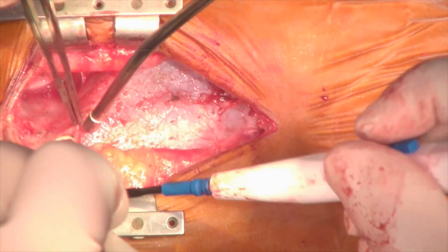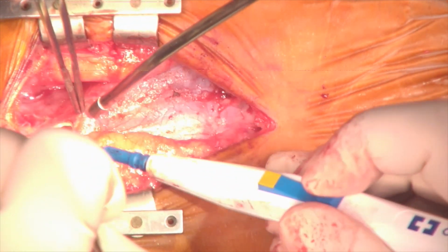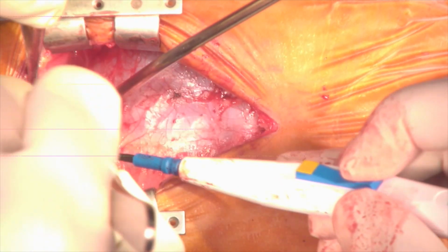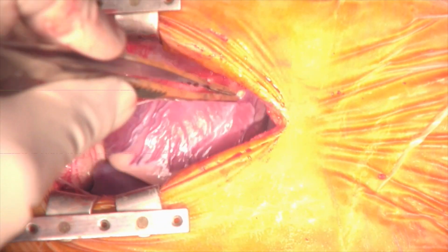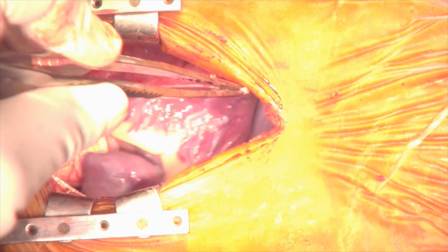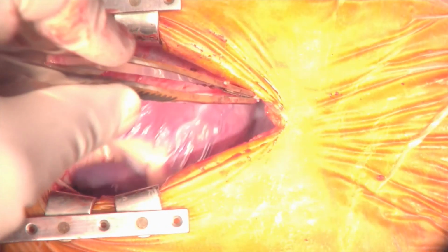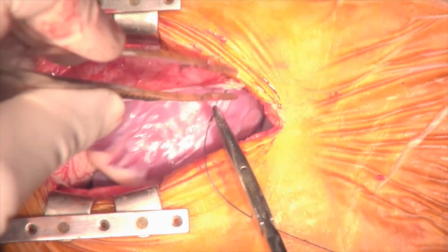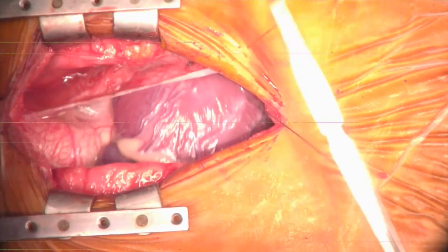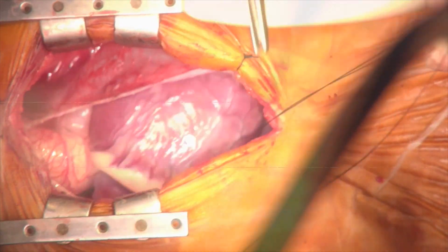The upper corner of the pericardiotomy is extended to the pericardial reflection at the ascending aorta. The pericardiotomy is then taken down to the surface of the diaphragm, where it is extended to the left and to the right, producing a T-shape. The edges of the pericardiotomy are then secured to the skin wound with silk stay sutures.